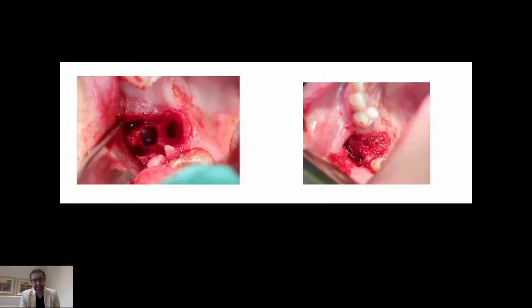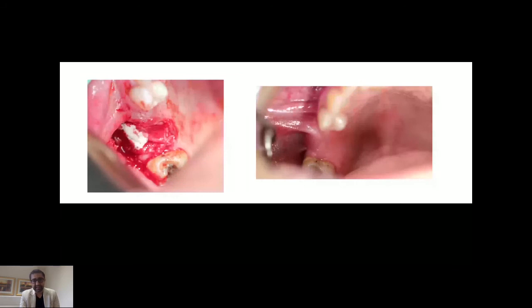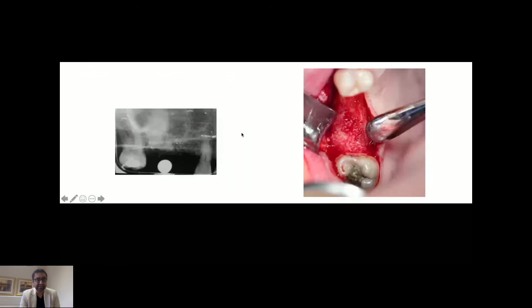And that's the bone graft we have placed. GBR technique, and that is healing. Now have a look at the post-op x-ray. Interestingly, we had 4 millimeter there, but because we planned the bone grafting in the same procedure without any additional anesthesia or any surgery, now we have got 10 millimeter of bone present post-operatively.